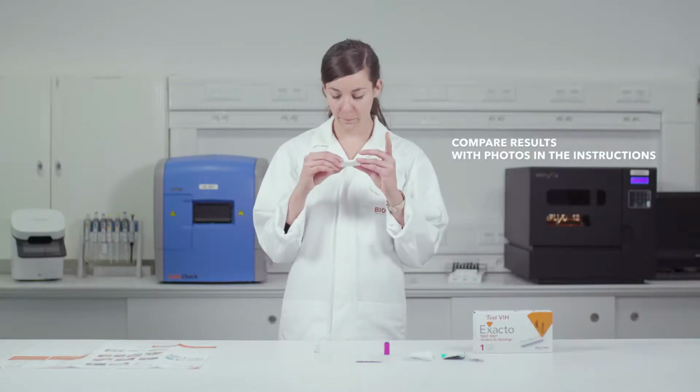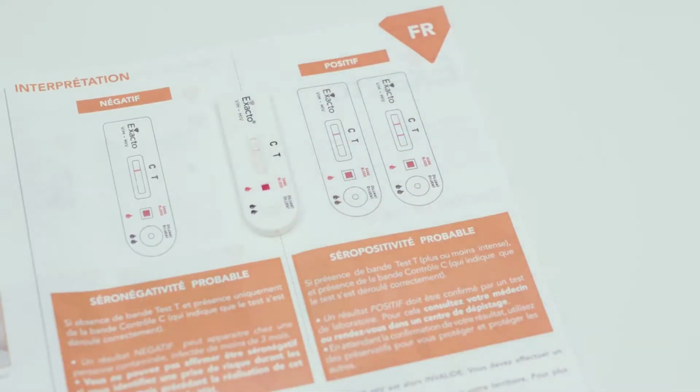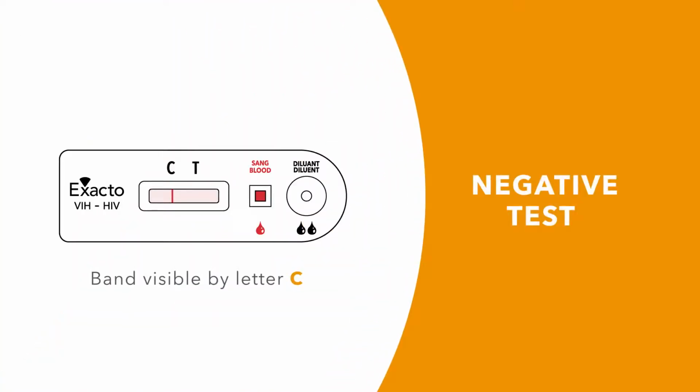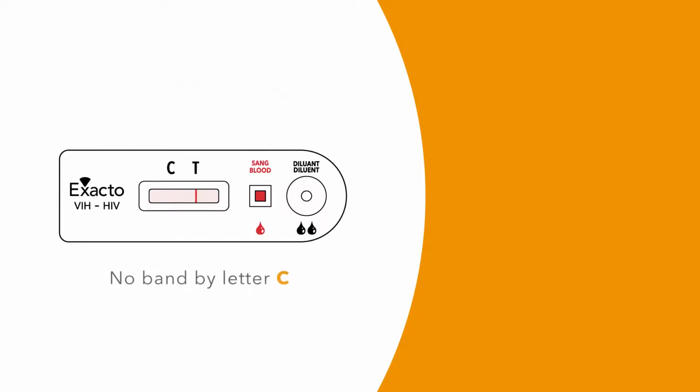After the 10 minutes are up, you can compare your results with the images provided in the instructions. If a band appears by the letter C, but not by the letter T, the test is negative. If a band appears by the letter C and by the letter T, the test is likely positive. The absence of a band by the letter C means the test is invalid. You must run the test again using a new cassette.